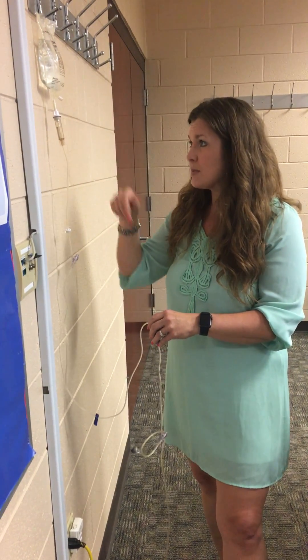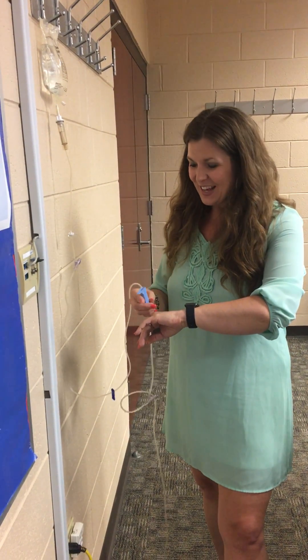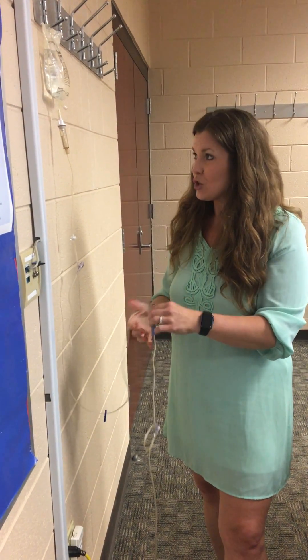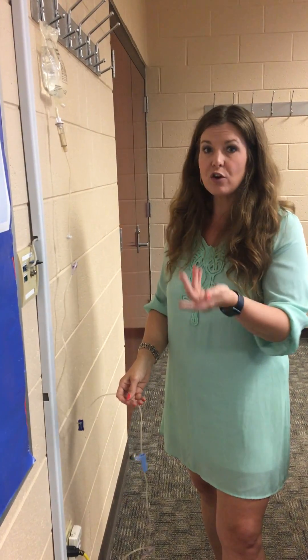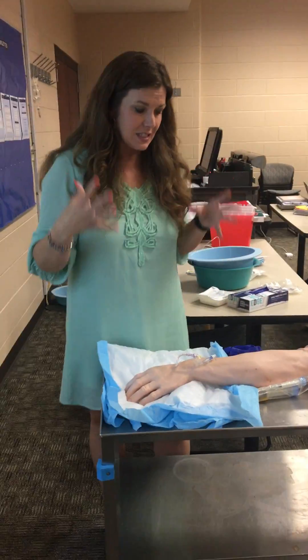Count the drops, adjusting the roller clamp. Try to stay calm and count, and once you've got it set at 60, 80, or 100 — whatever we prescribe — that's your rate. Just say you're ready. That's the first part of the assessment. Then you'll move over to the arm, and at this point you're still continuing the assessment part.